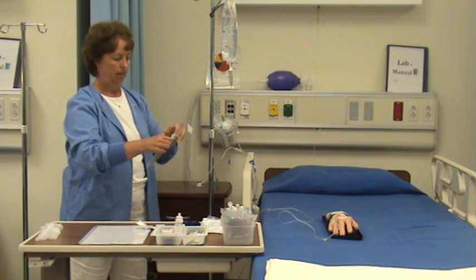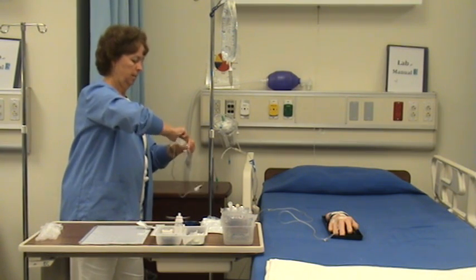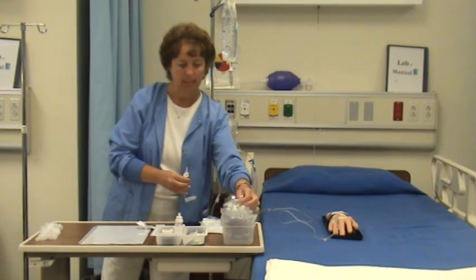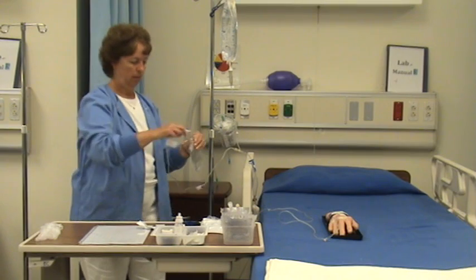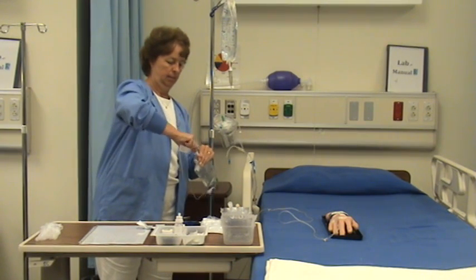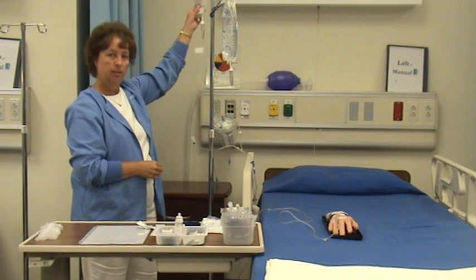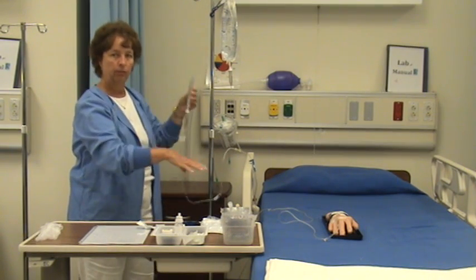Now that I've done that, I'm going to take this off. And then hang my next antibiotic. And start the process over again. That's called back flushing.